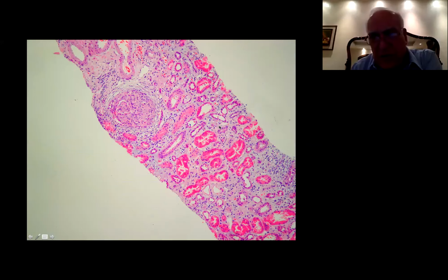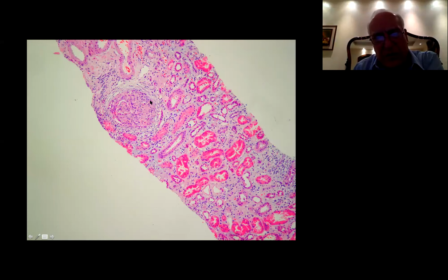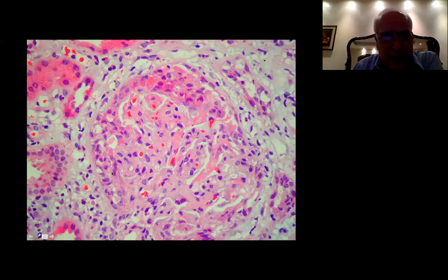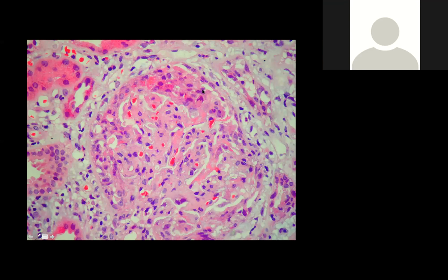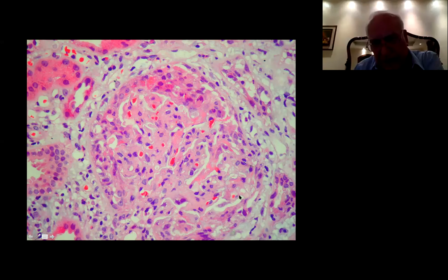All this is collagen. And we see this glomerulus here. We see the blood vessel with thickened wall. Let's go to higher magnification. This is the glomerulus. See it, the capillary loops, basically you don't see them, it's closed, and you start seeing a crescent. This crescent is forming here. With normal basement membrane, we can't really talk about it because it's very difficult with this kind of infiltrate and disease, mesangial process that you have.